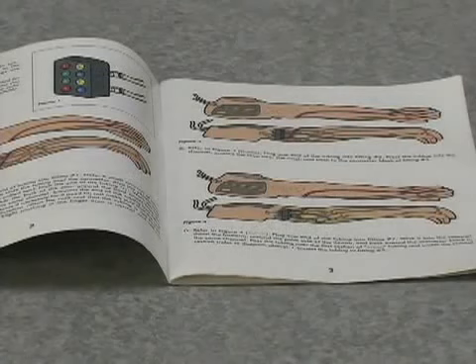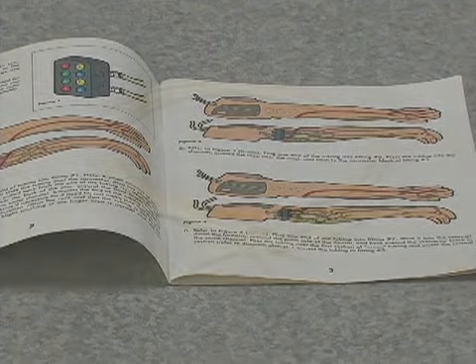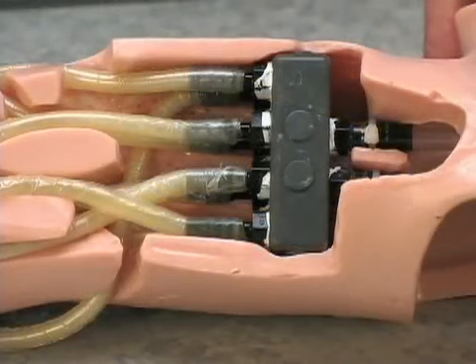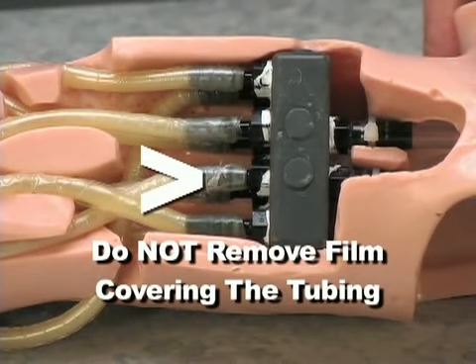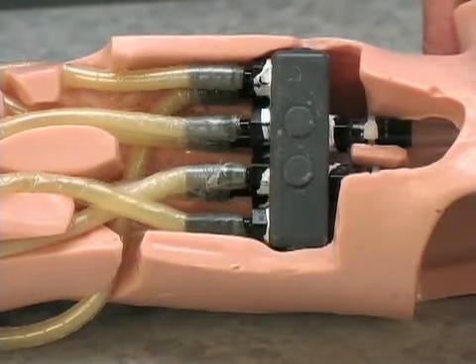Please follow along in the color-coded instruction manual. This will enable you to install the veins correctly. In the kit, you receive 4 replacement veins of the same color and length. They may be used interchangeably. Additionally, do not remove the film from the replacement tubing, as this will negatively affect the quality of the arm. These veins connect into the 8 fittings on the connector block.